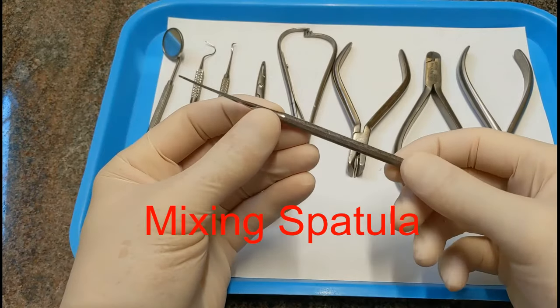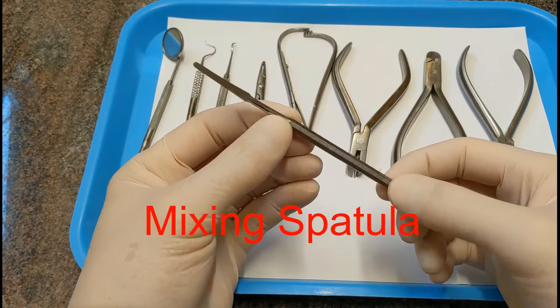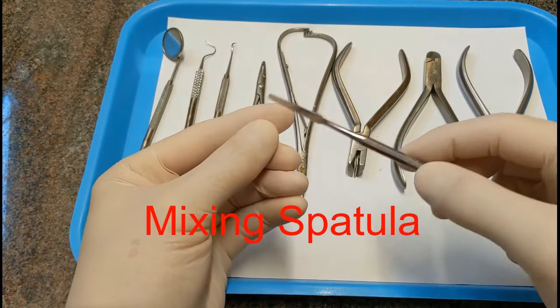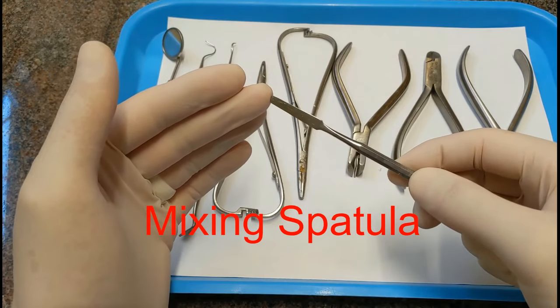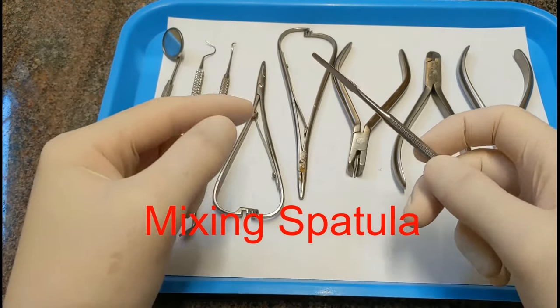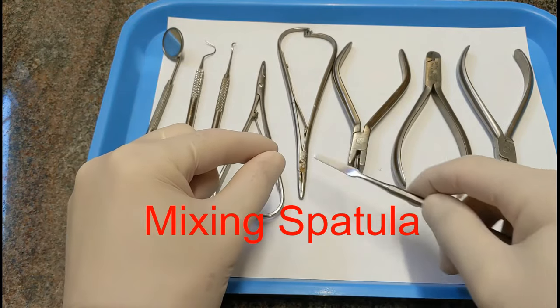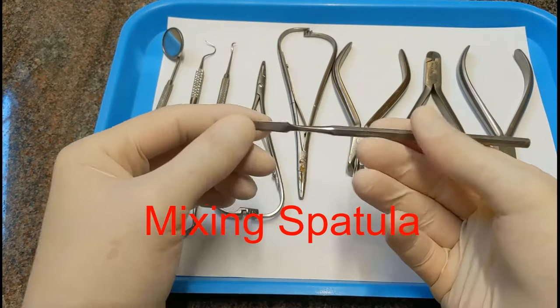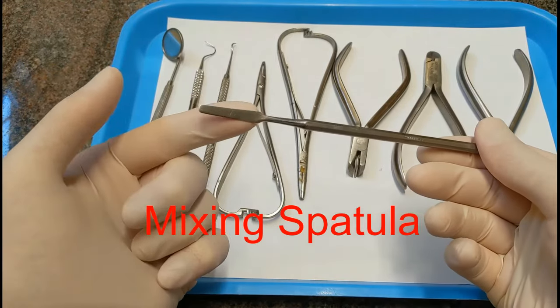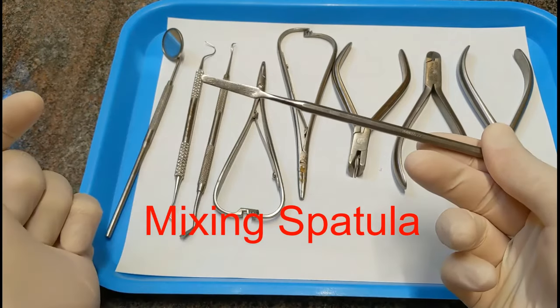This is called a spatula, or mixing spatula. It's meant for mixing up different two-part compounds. Our band cement is a two-part with a liquid and a powder — you use this to mix them together, then scoop it up and place that cement inside the band. Some spatulas have a small head and some have a longer, wider head, but they're both called mixing spatulas.